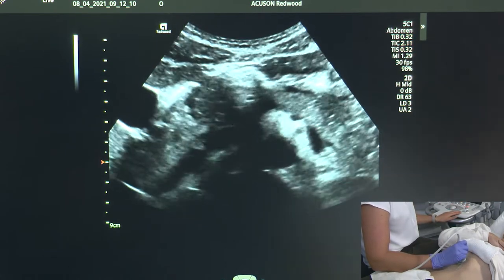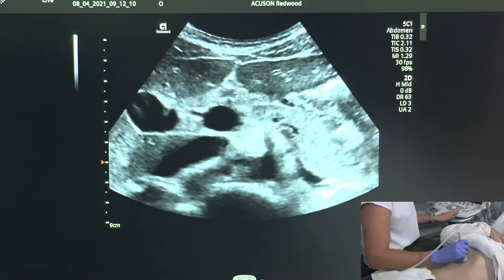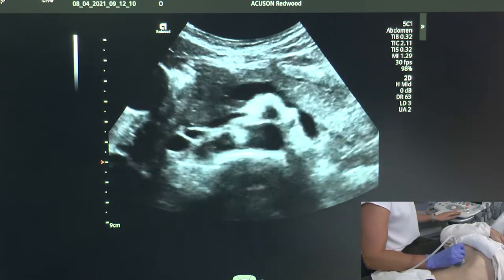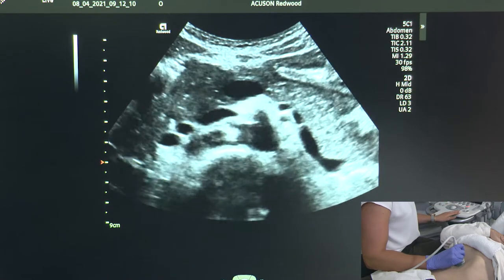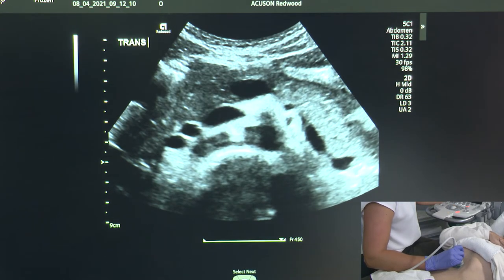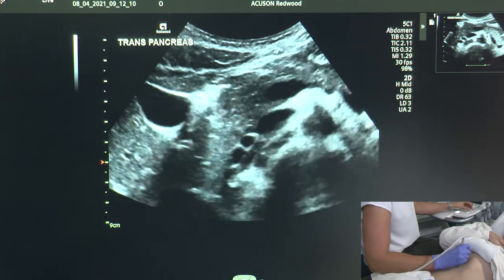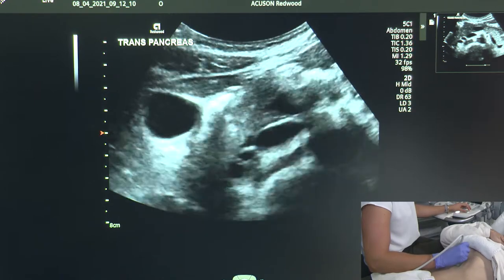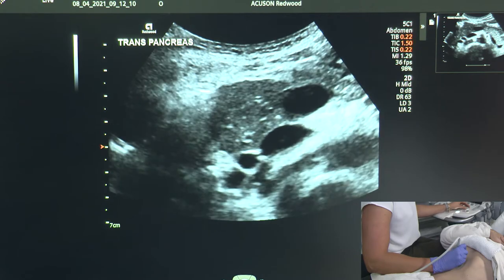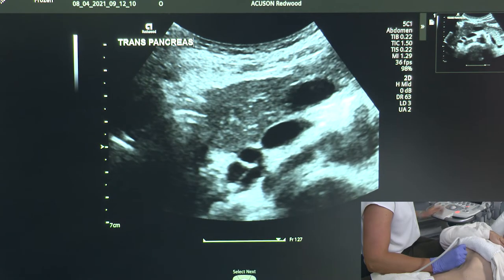The first thing I'm going to do is take an overall gland shot of the pancreas. Take a nice big breath and hold it. Here we can see the lovely pancreatic body and tail — we can annotate this 'trans pancreas.' The next thing I might do is take a picture just of the pancreatic head, adjusting our depth to match what we are imaging, and annotate it 'trans pancreas H' for head.